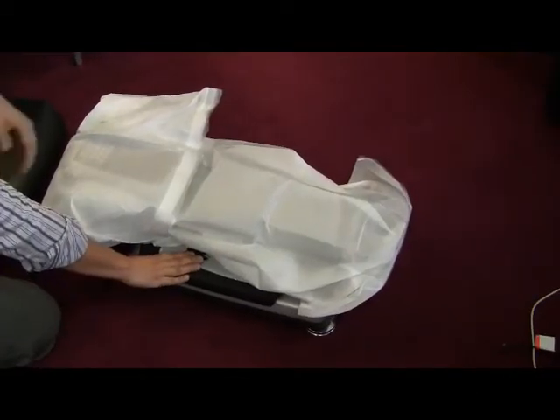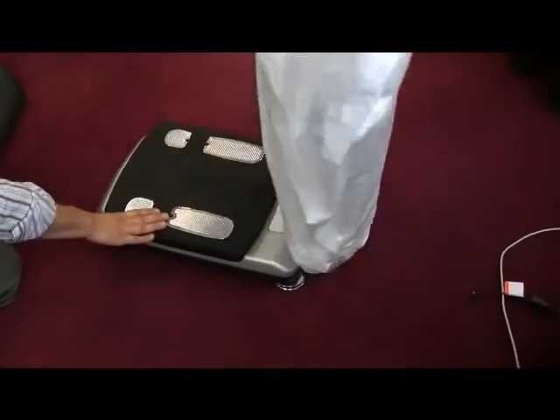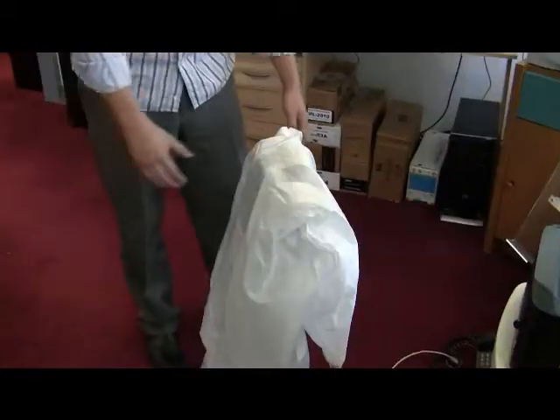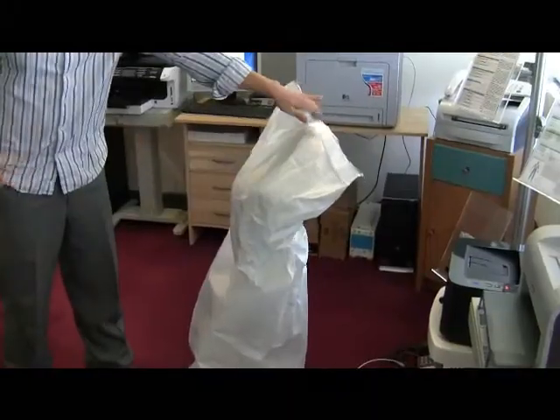Unfold the InBody 230. While applying pressure to the footplate, lift the stand until it is upright. Lift the head and lower the arms. Remove the protective cover.